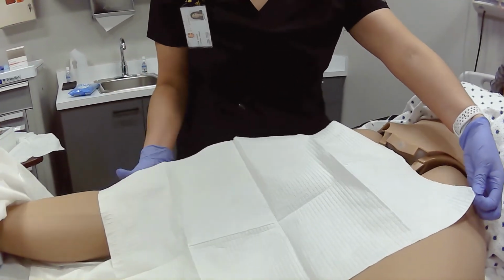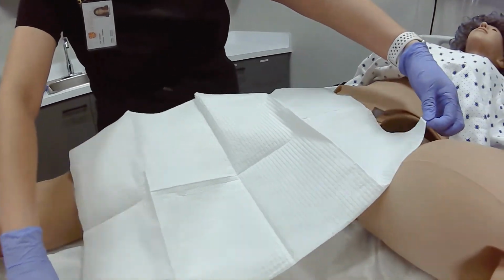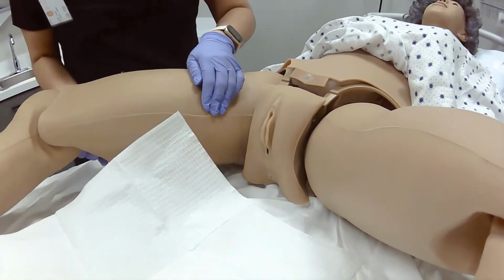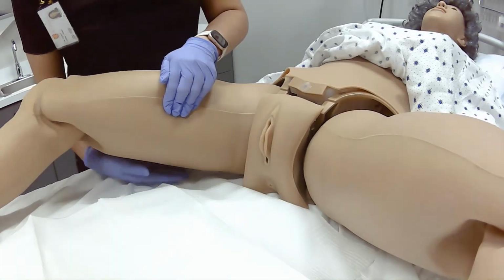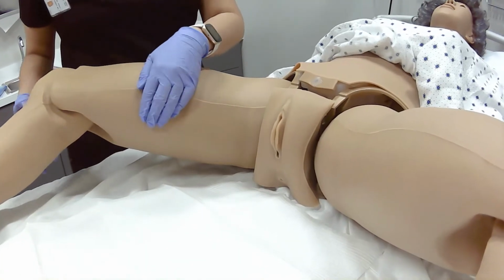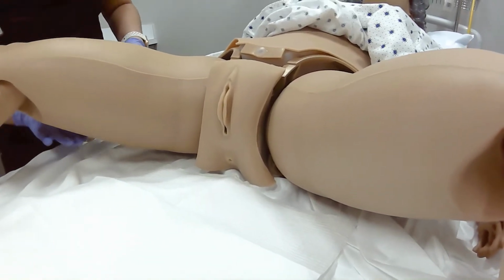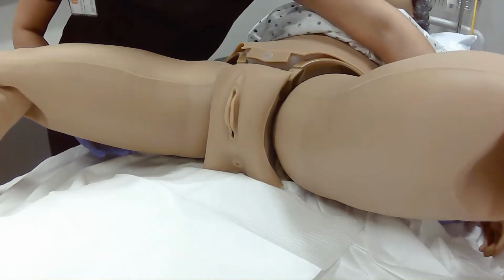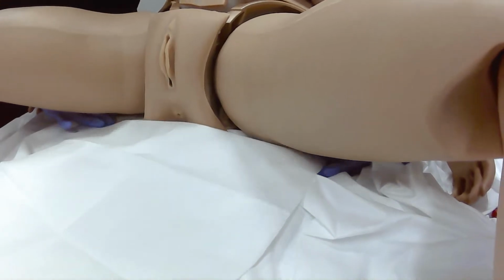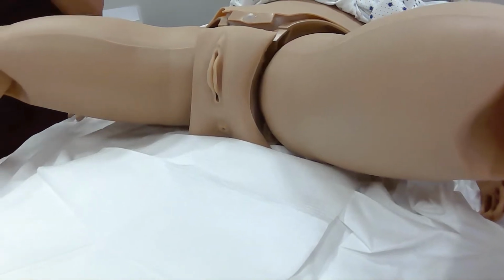And it's actually going to be better if you have your patient with their legs open like so, so that way you can place your drape and do everything that you need to do. I neglected to do that at the beginning, but that's okay. Now in some cases your patient might not be able to hold their legs bent like this, so you can get help. Okay, and I'm adjusting this without contaminating the middle. So never touch the middle because that is sterile. Don't touch it with your non-sterile gloves.